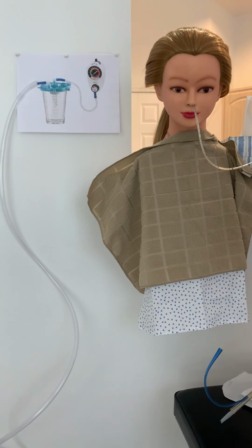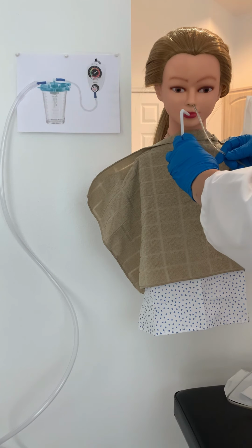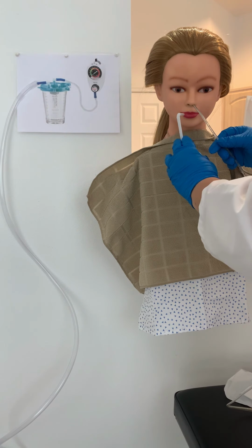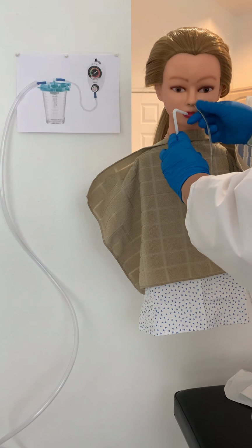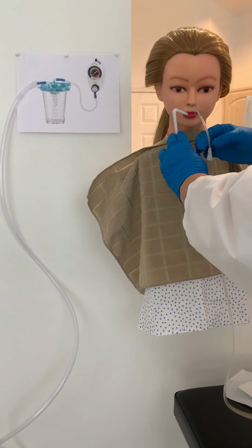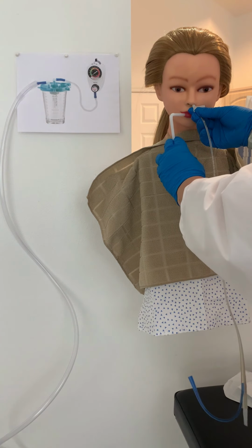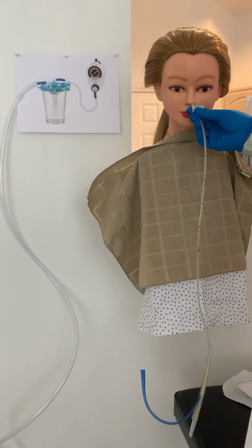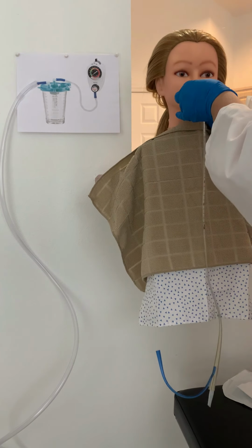And I'm going to give you this cup of water here. So every time I say swallow, take a swallow and I'll push the tube down, okay? So go ahead and swallow, swallow, swallow, swallow, and swallow. Okay, good. The tube is down. Are you having any difficulty breathing at all? You can put your head back up.